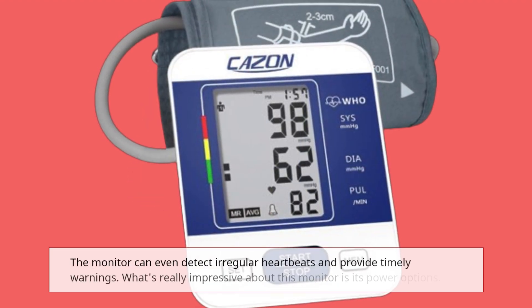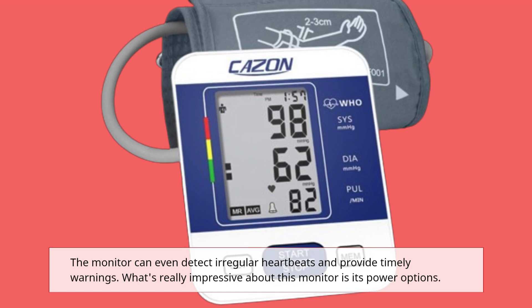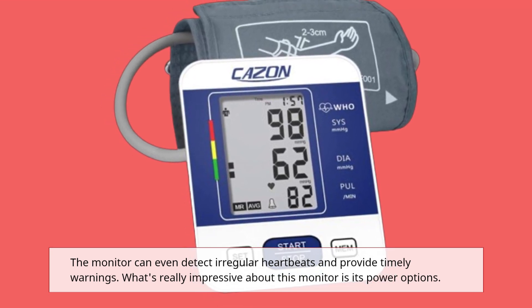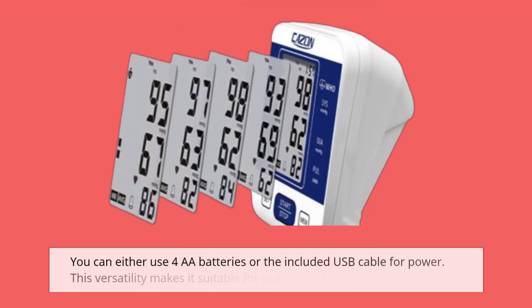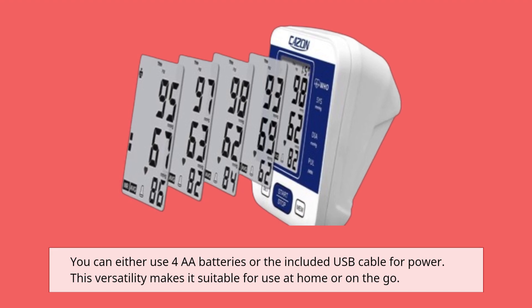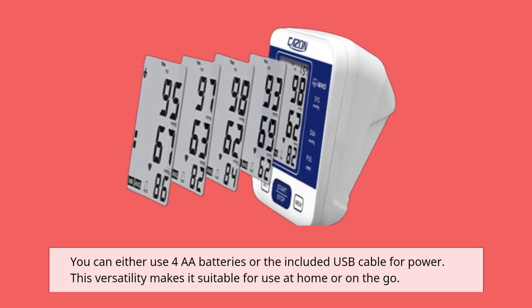The monitor can even detect irregular heartbeats and provide timely warnings. What's really impressive about this monitor is its power options — you can either use four AA batteries or the included USB cable for power. This versatility makes it suitable for use at home or on the go.